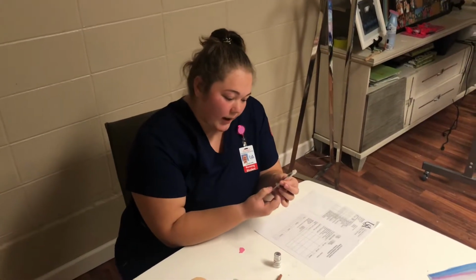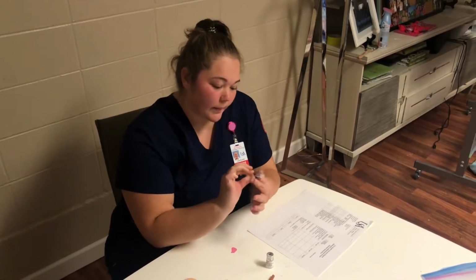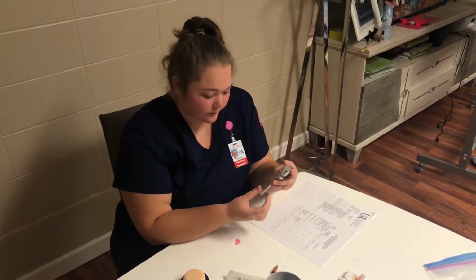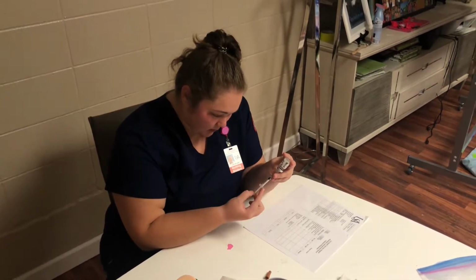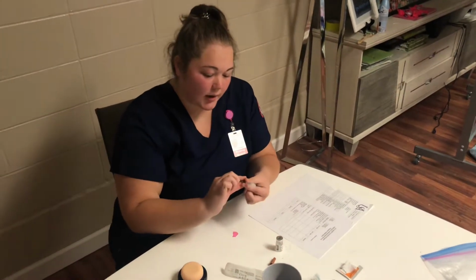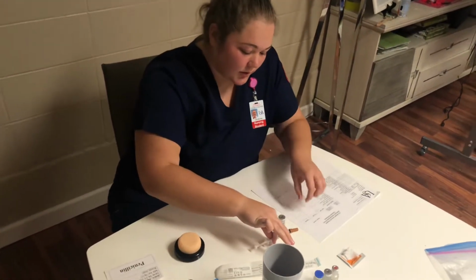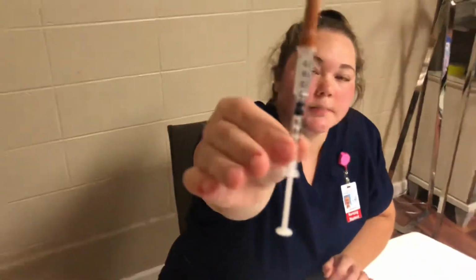I'm going to draw back 0.5 milliliters of air and inject it into the heparin. Now I'm going to draw up 0.5 milliliters of heparin. I'm going to recap my needle using the scoop method. I'm going to show you this is 0.5 milliliters.